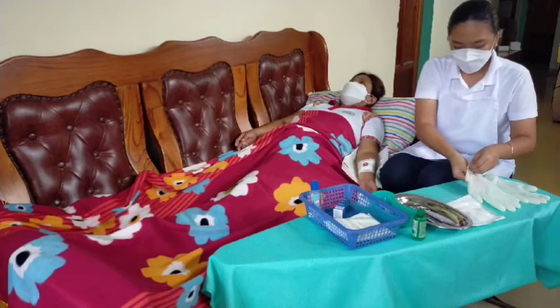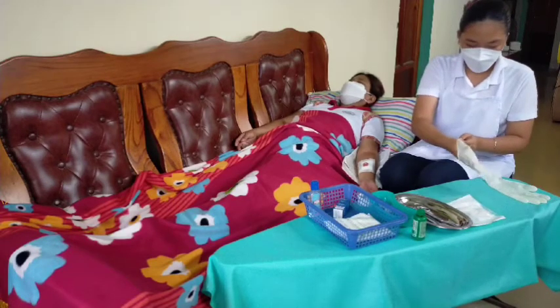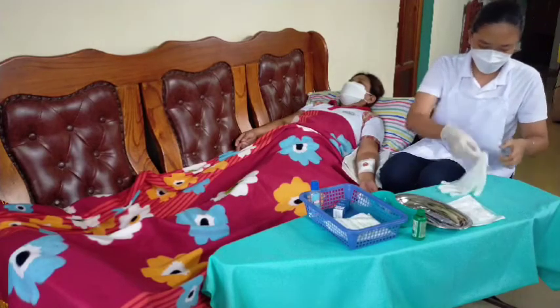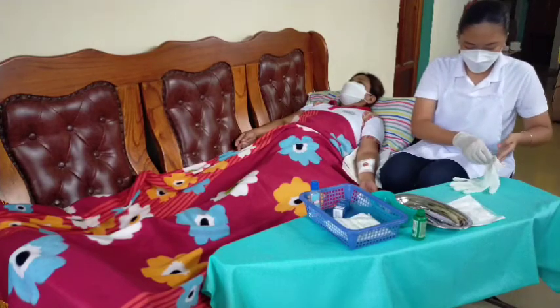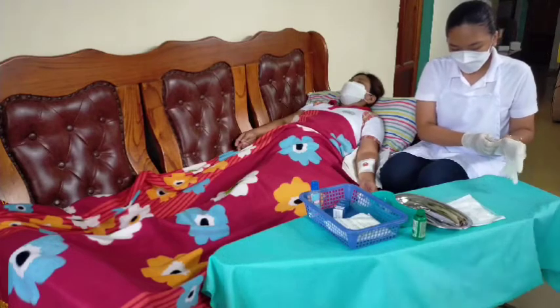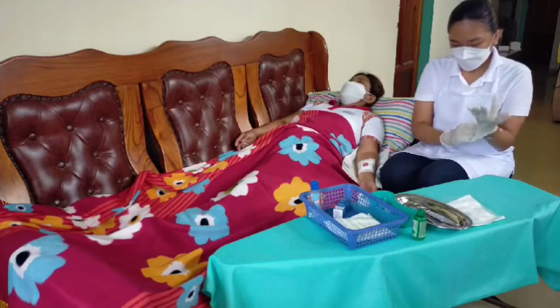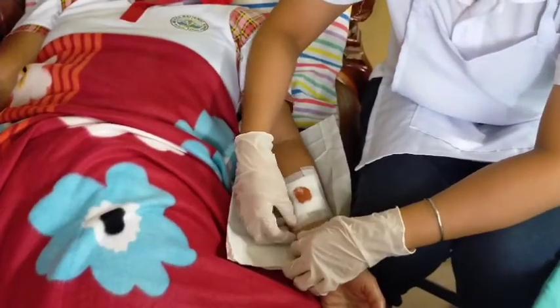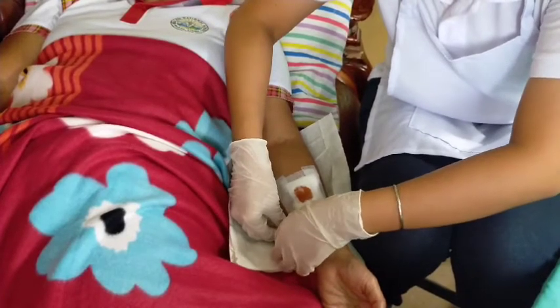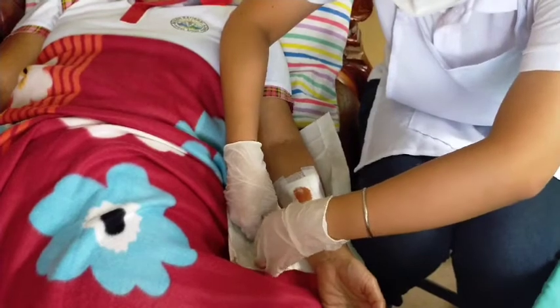Now, we're going to put on clean disposable gloves. And we're going to loosen tape on the old dressing. If necessary, we can also use adhesive remover to help get the tape off.